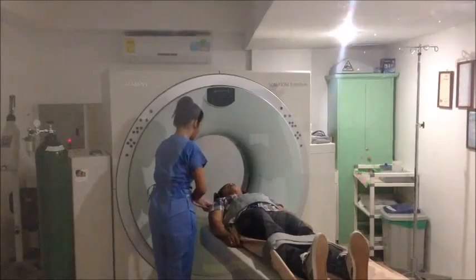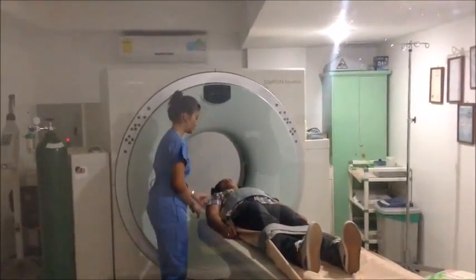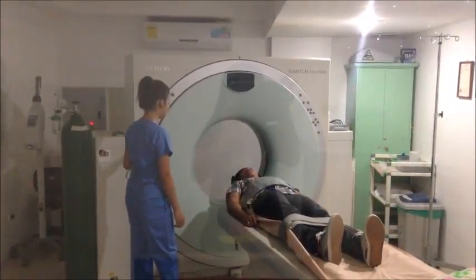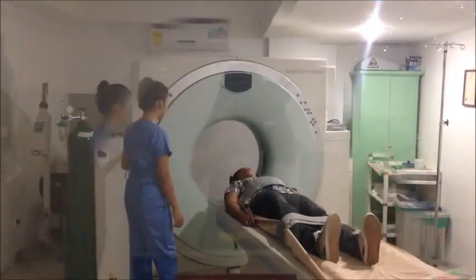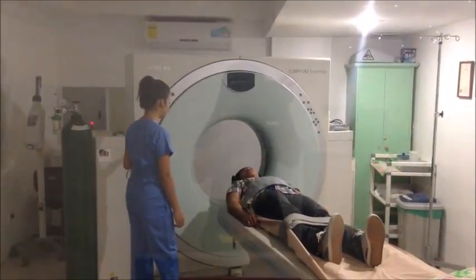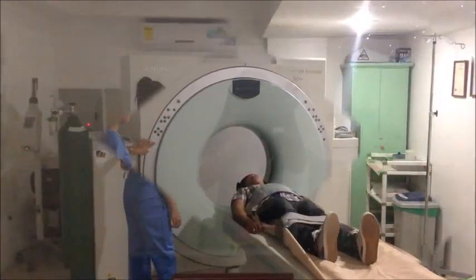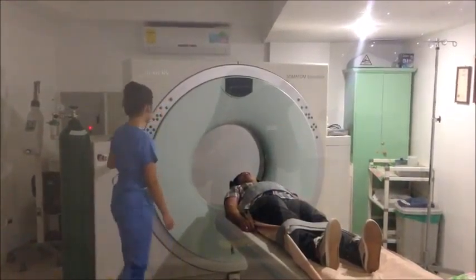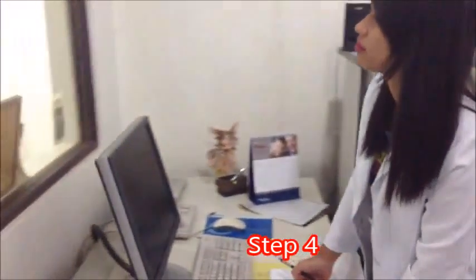It is important during the CT scan procedure that the patient minimizes any body movement by remaining as still and quiet as possible. This significantly increases the clarity of the X-ray images. The CT scan technologist tells the patient when to breathe or hold his or her breath during scans of the chest and abdomen. If any problems are experienced during the CT scan, the technologist should be informed immediately.